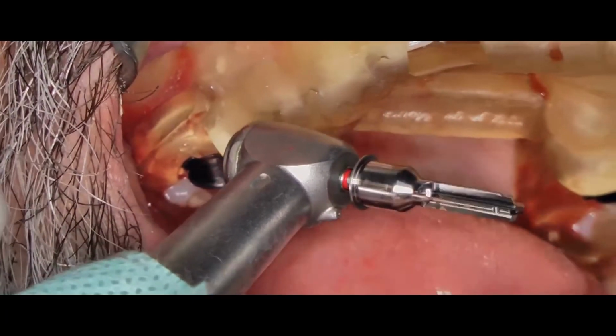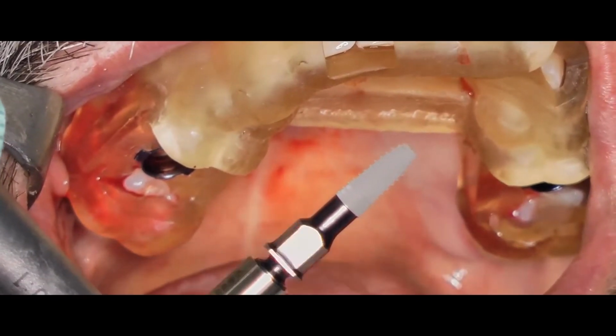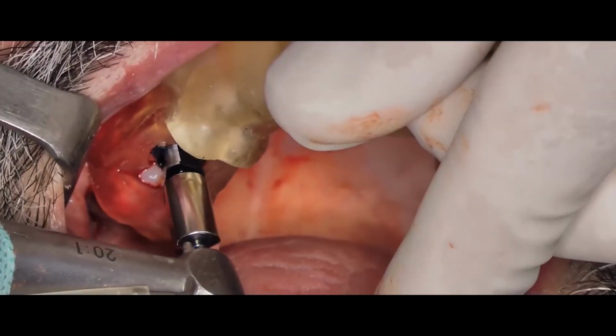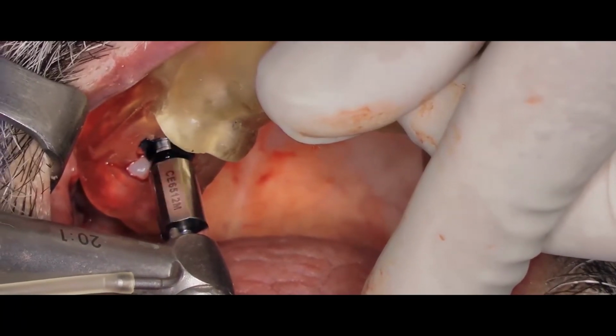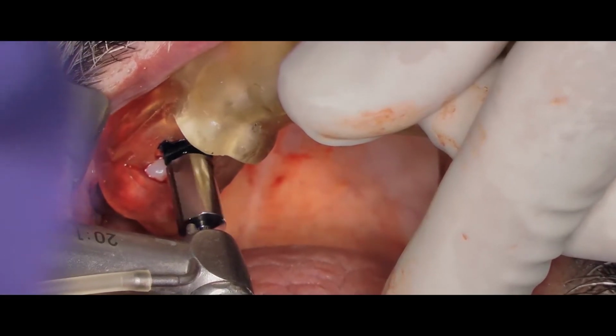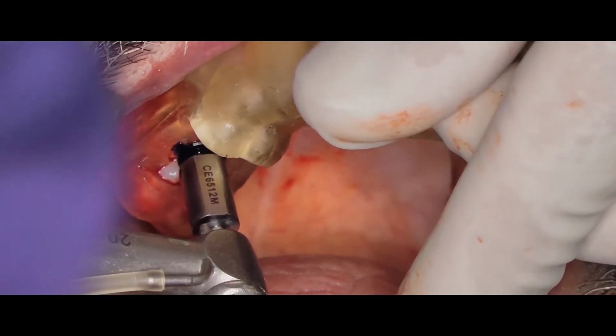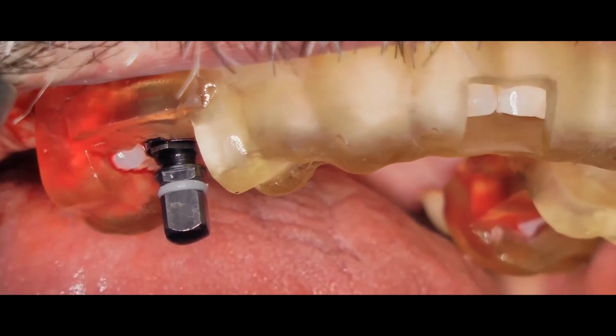We will be placing regular size implants here, and what we need to make sure is to align the prominence of the guide with the mark on the mounter. This will ensure that an internal hexagon side is facing the vestibular. We are using a 9mm fixed offset mounter, so no need to worry about depth. We are at the correct depth when the mounter stop hits the guide stop.